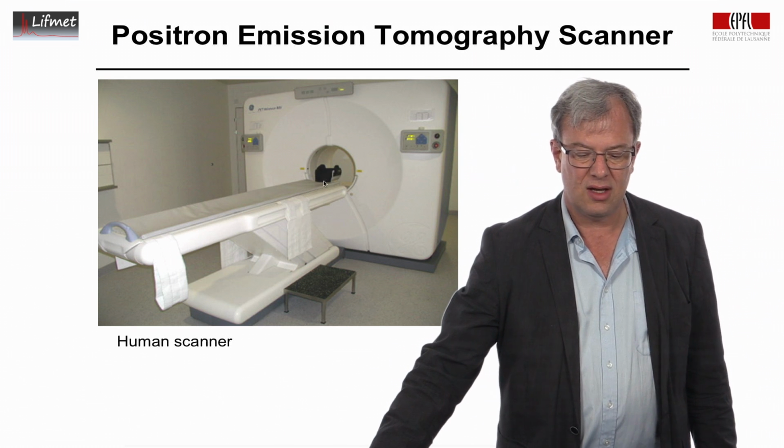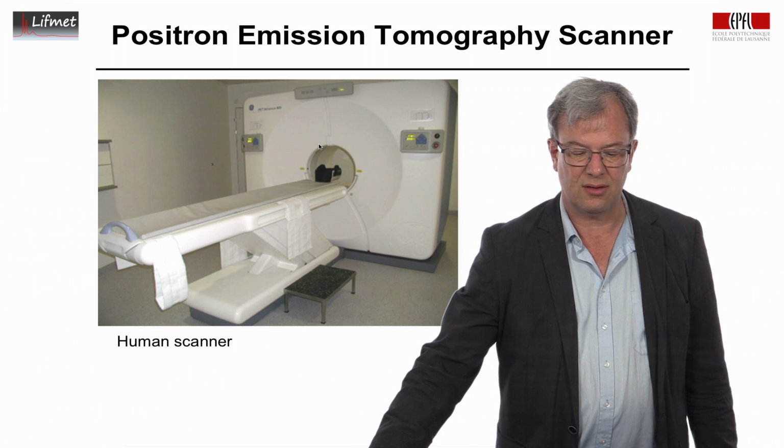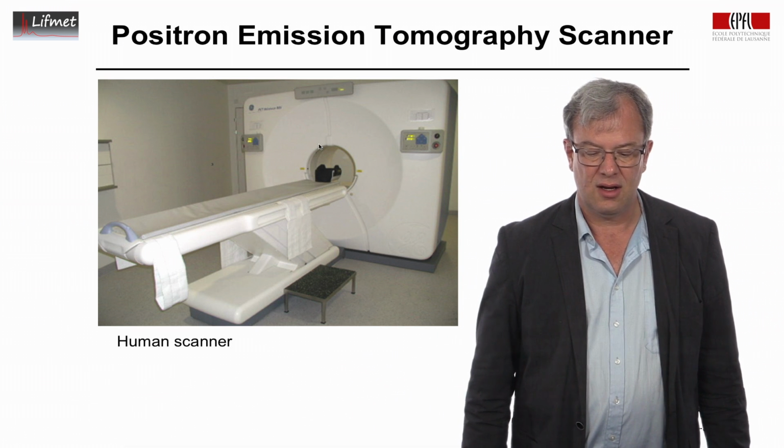The patient bed. Here's a holder. This is now set up for a brain scan here for the head. And this will go here into the hole where the detection is being done of the PET scan.